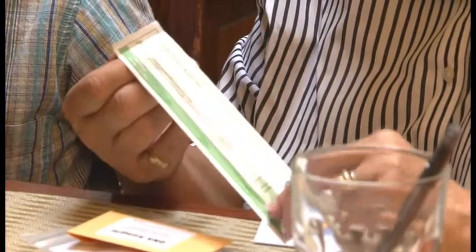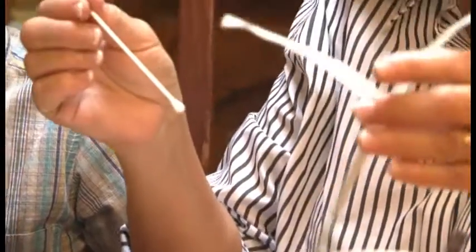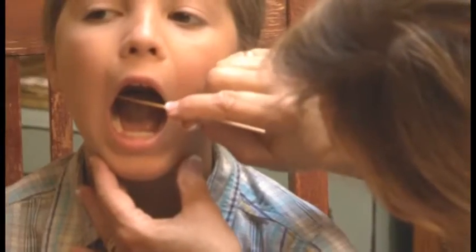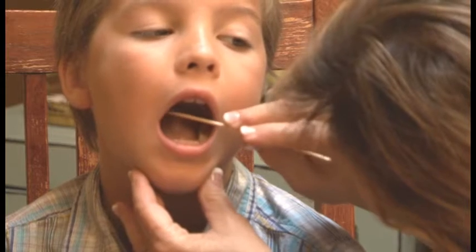Now, carefully tear back the peel end of the cotton-tipped applicator envelope and remove the swab. And again, don't touch the cotton end of the swab, as that could also contaminate the sample. Don't throw the paper carrier away, because you'll need to use it again later.